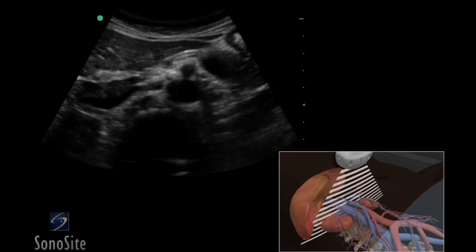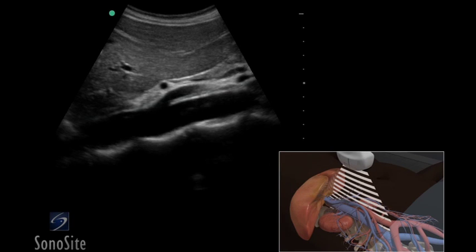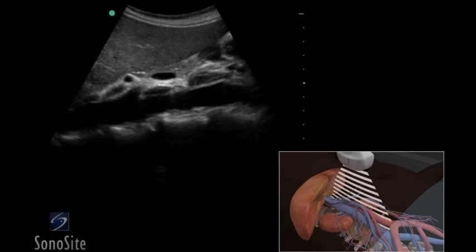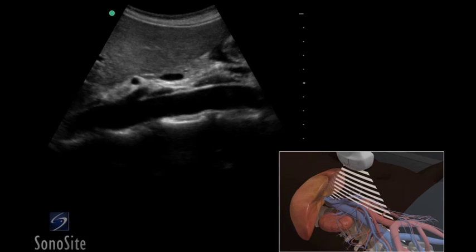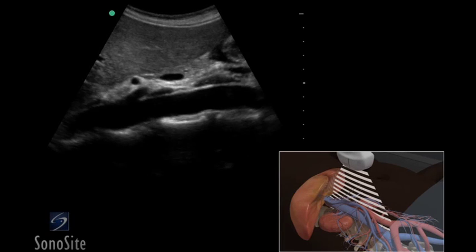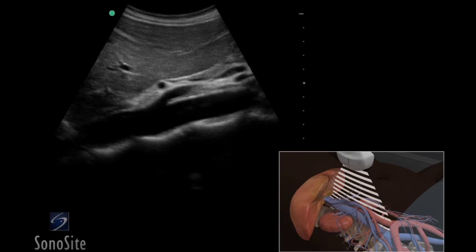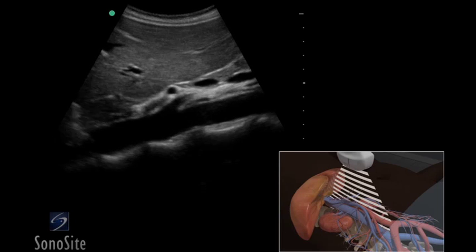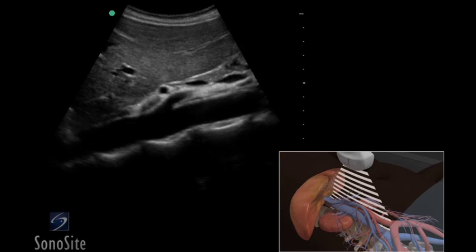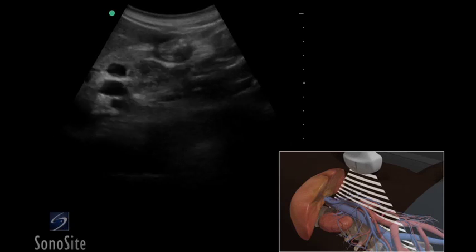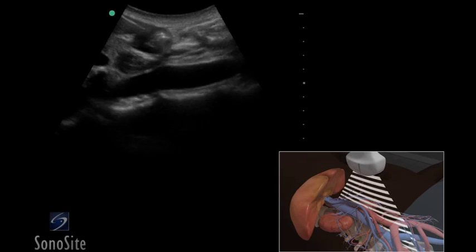Measure in long and short axis views from outer wall to outer wall to determine the true diameter. The transducer is then returned to the epigastric area and rotated 90 degrees clockwise with the orientation marker to the patient's head. The transducer is swept side to side to identify the maximal diameter of the aorta, noting the proximal to distal taper. The transducer is moved distally to evaluate the walls of the aorta for any change in shape or size.